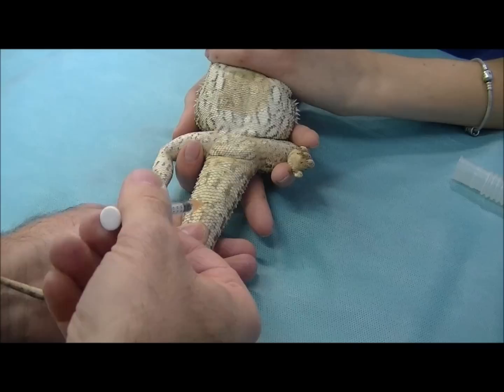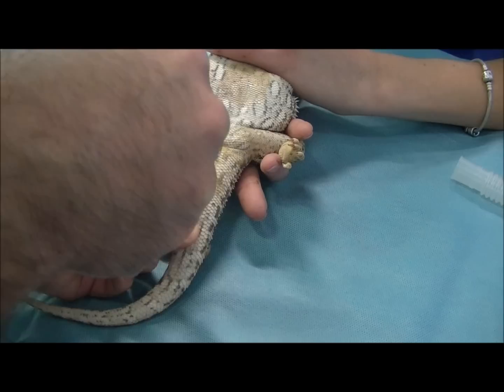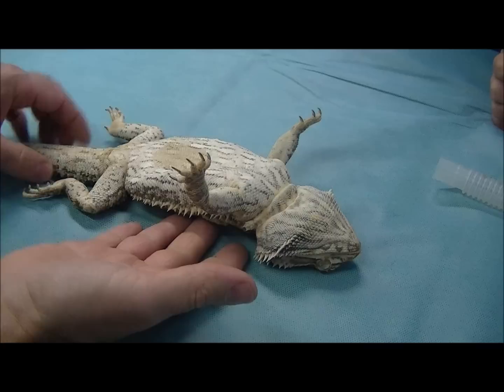We aim for the midline, under the scale, lift it up, and go down until we get a flush of blood into the syringe hub — I've got a little bit there. So we inject that now, over about 5 seconds, pull it out, and just keep a bit of pressure on there. They can bleed a little bit after you take the needle out, and we'll let her go to sleep.